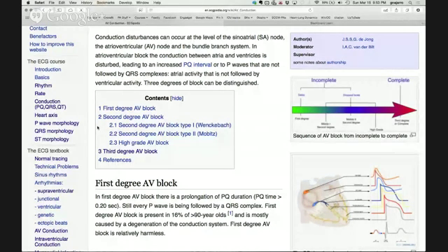label something. Just today in our unit, we had a patient who was transferred in with a flutter, and we were going to cardiovert them. Well, we got an EKG, and it showed normal sinus rhythm on the read, but we all knew that this was not a flutter. So keep in mind that the machines are not reliable.